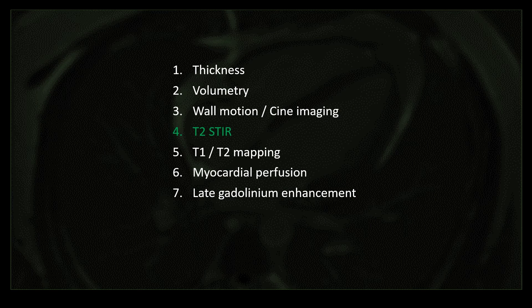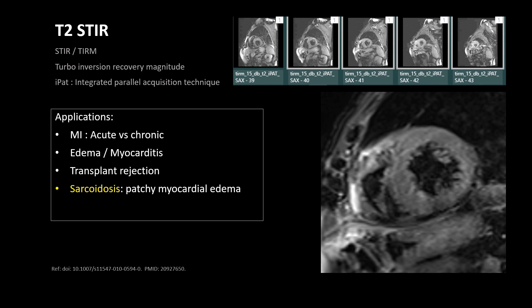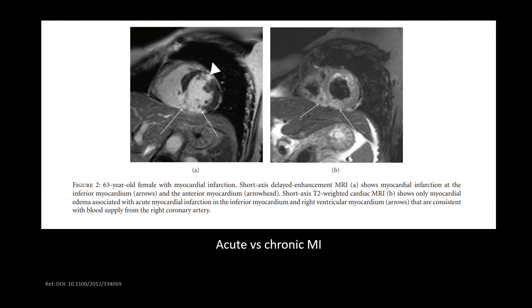Now coming to T2 STIR images. Just like any other part of the body, STIR is mainly used to look for edema. In cardiac MRI, STIR images appear as TIRM or black blood imaging. Applications include differentiating acute versus chronic MI, looking for myocarditis or transplant rejection, and detecting patchy myocardial edema in sarcoidosis. For example, on a late gadolinium enhancement image showing two areas of enhancement, if the corresponding STIR image shows edema in only one area, we can conclude that one is an acute infarct and the other is a chronic infarct.